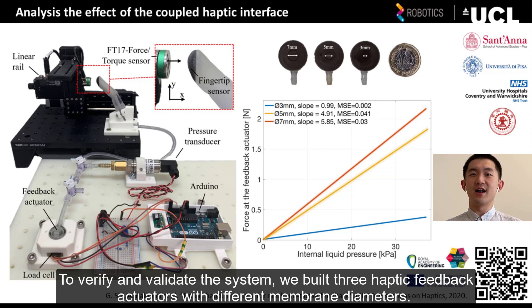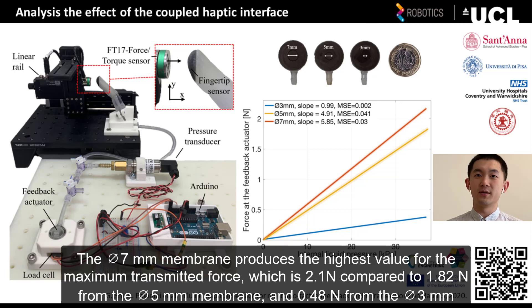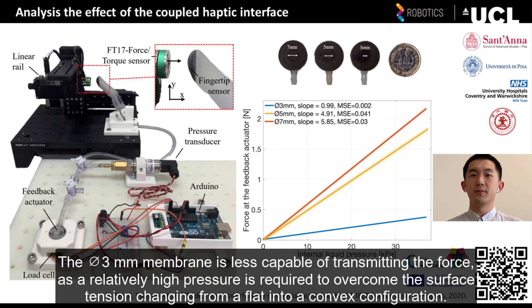To verify and validate the system, we built three haptic feedback actuators with different membrane diameters. You can see the test rig made of a linear rail and the force torque sensor on the left. The 7 mm diameter membrane produces the highest value of the maximum transmitted force, which is 2.1 N, compared to 1.82 N from the 5 mm diameter membrane, and 0.48 N from the 3 mm diameter membrane. The 3 mm diameter membrane is less capable of transmitting the force, as a relatively high pressure is required to overcome the surface tension, changing from a flat into a convex configuration.